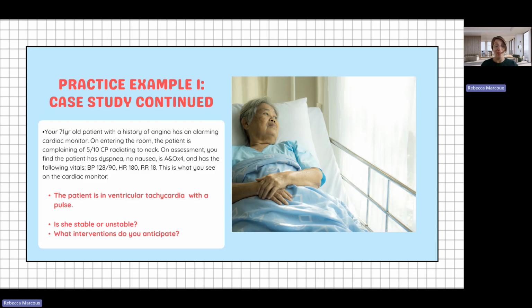So it's really going to depend with this case study, and I made it purposefully challenging to try and decipher because patients are always kind of in between, and it's up to us as clinicians to really think about it and think about what could be happening, think about risk for deterioration, what signs that you're looking at.